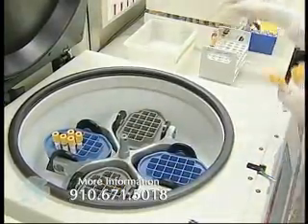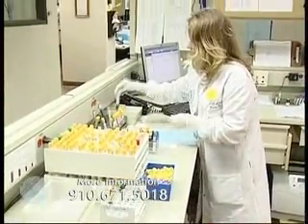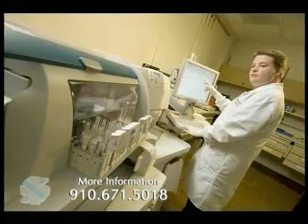25% of those tests are on an outpatient basis. Those patients will either come to the laboratory and present themselves to the laboratory where their specimens are collected, or we also offer courier services to our physicians that use our services to pick their specimens up and bring them into the lab. Those specimens are brought back into the lab, analyzed, and results are released both electronically and through a paper trail, depending on what the needs of the physicians are.